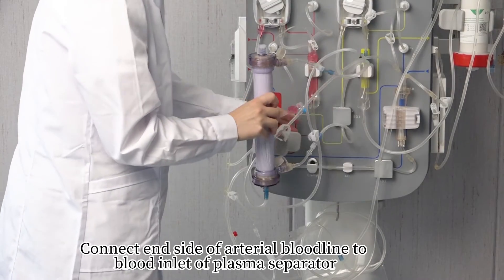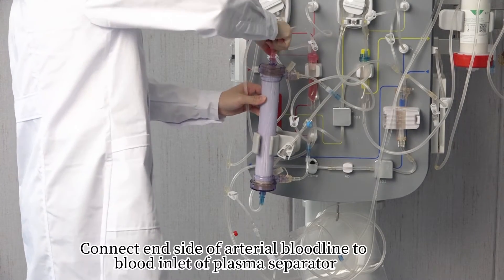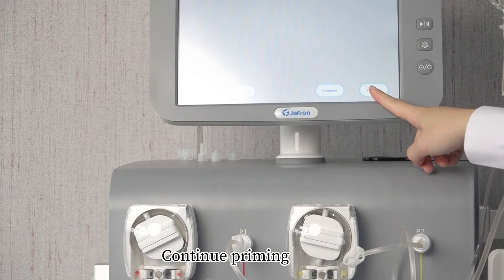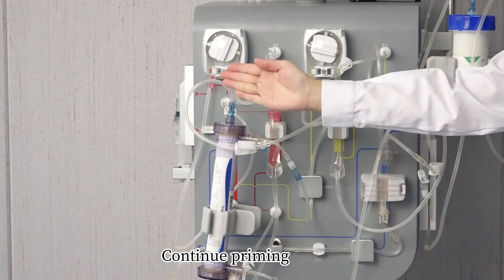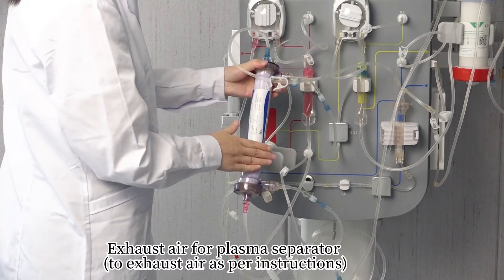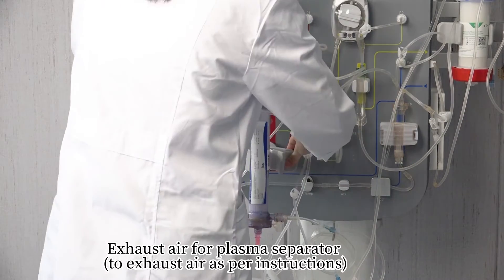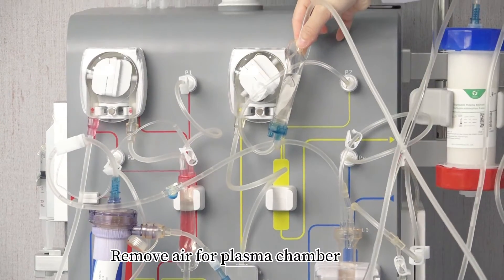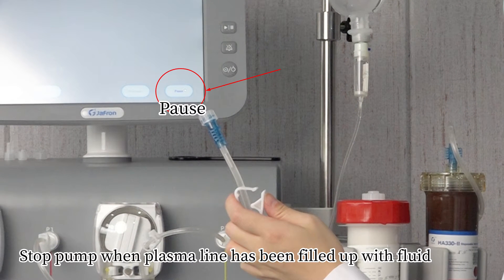Connect the end side of the arterial bloodline to the blood inlet of the plasma separator. Continue priming. Exhaust the air from the plasma separator and remove air from the plasma chamber. Stop the pump when the plasma line has been filled with fluid.